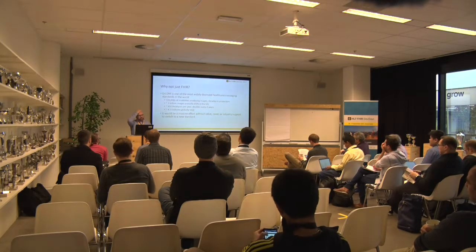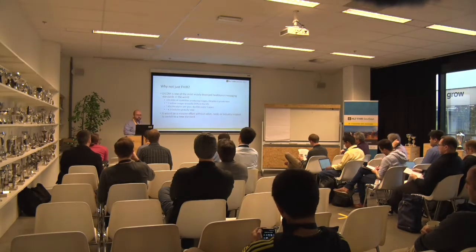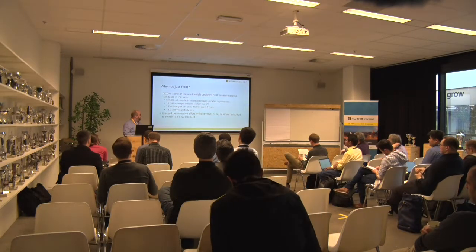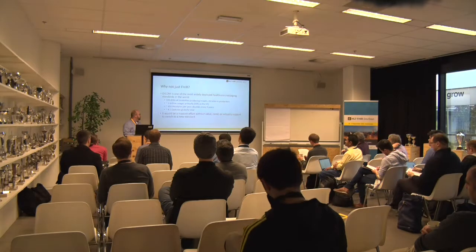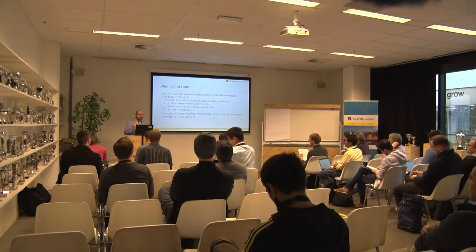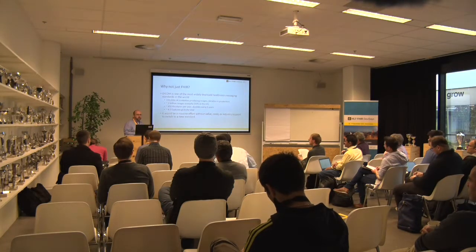So why would we not just use FHIR? Why don't we just move to FHIR? DICOM has been one of the most widely deployed healthcare messaging standards in the world. Hundreds of thousands of modalities are producing these images, and they're there for the long haul. It's not like a mobile phone that you go through every 2 or 3 years. Someone will buy this and it sits there for 20 years. And they're not really easy to upgrade.